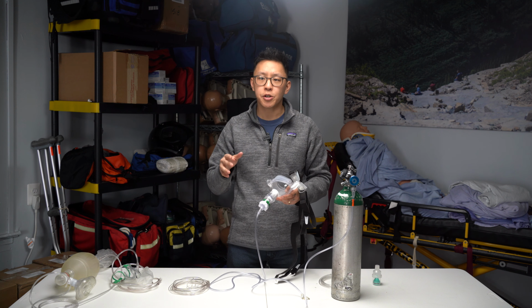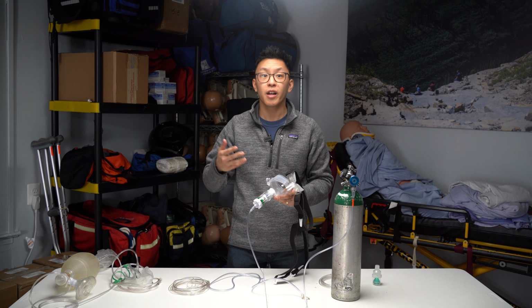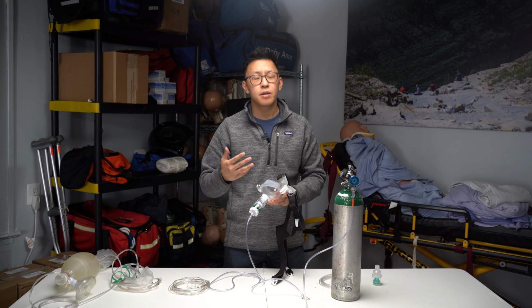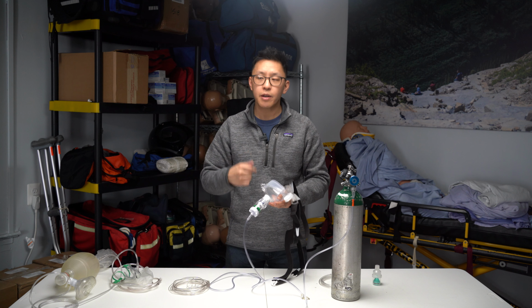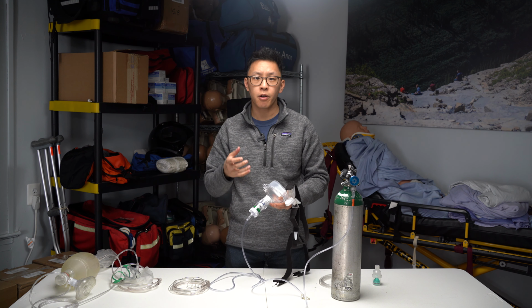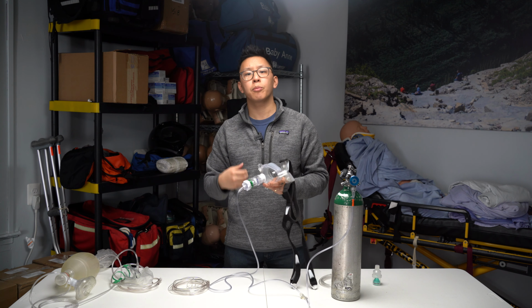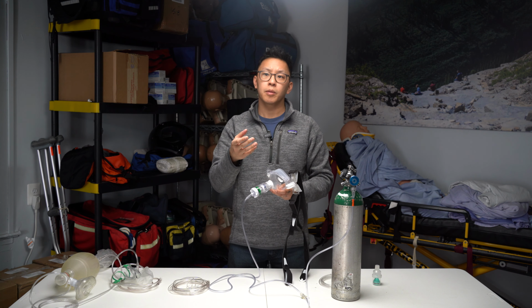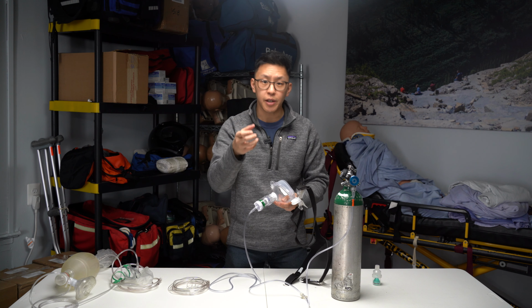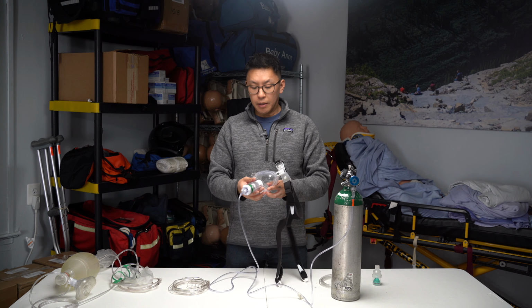It is the amount of pressure that is created within your alveoli, or left within your alveoli at the end of your exhale. And so people with COPD, emphysema specifically, have a hard time maintaining the structural integrity of their alveoli. So when they exhale, their alveoli might collapse. And this positive airway pressure maintains that compliancy, right? I don't know if I just made that up, but that integrity of the alveoli, allowing for gas exchange to continue to occur.